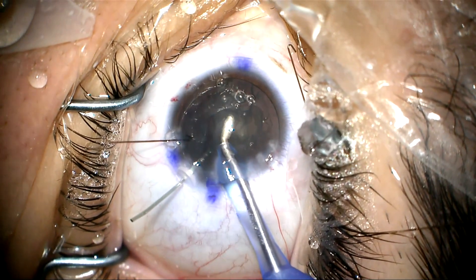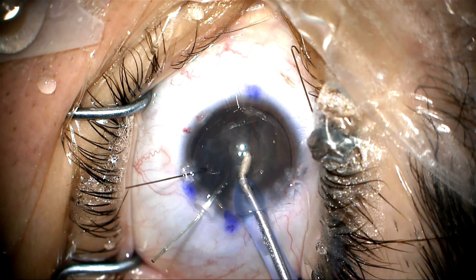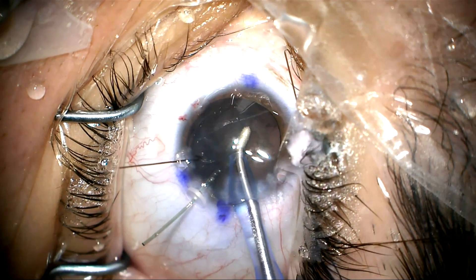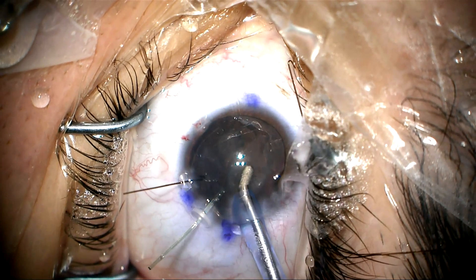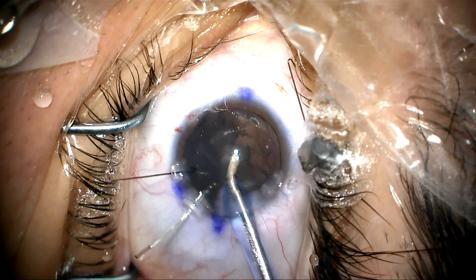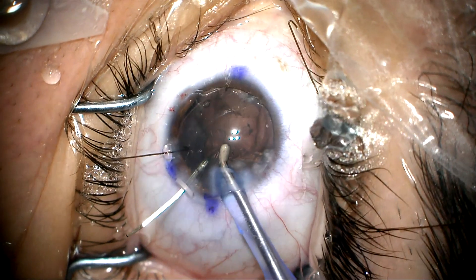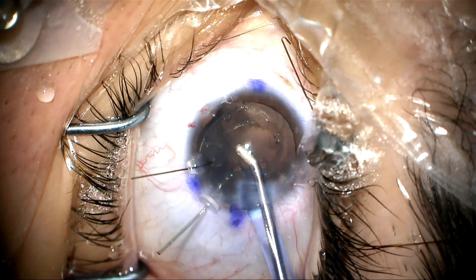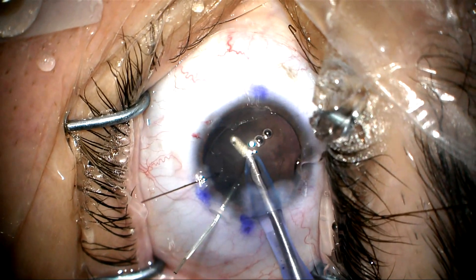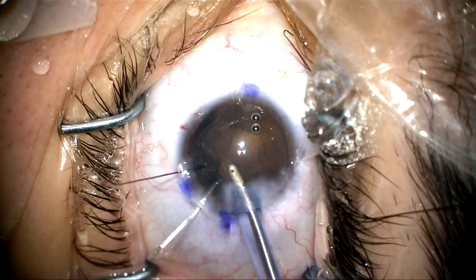Now we're going to go ahead and aspirate the lens. This is a 19-year-old girl and the lens is quite soft, so we don't need phaco — we can just aspirate the soft lens. The patient's vision was poor because the lens was displaced and dissecting her pupil, but there really is not that much opacity here. The lens is misshapen, and that creates irregular astigmatism, but we're going to be removing that. Our goal is to preserve the capsular bag, so we're cleaning this out with irrigation-aspiration. This is somewhat edited.